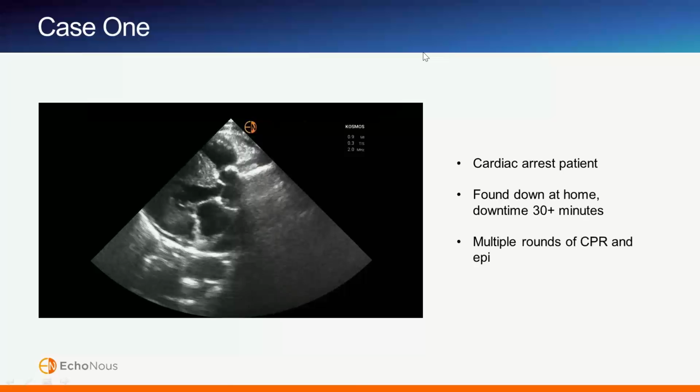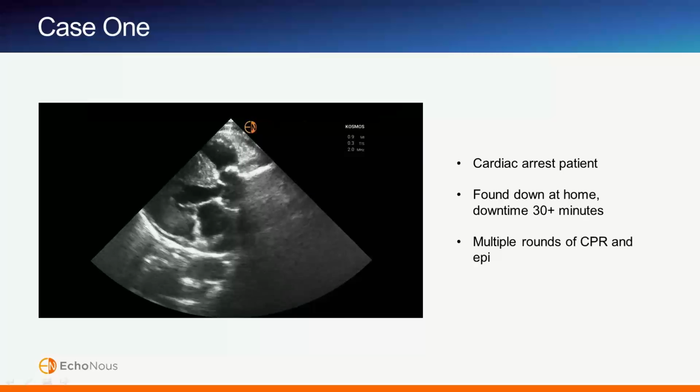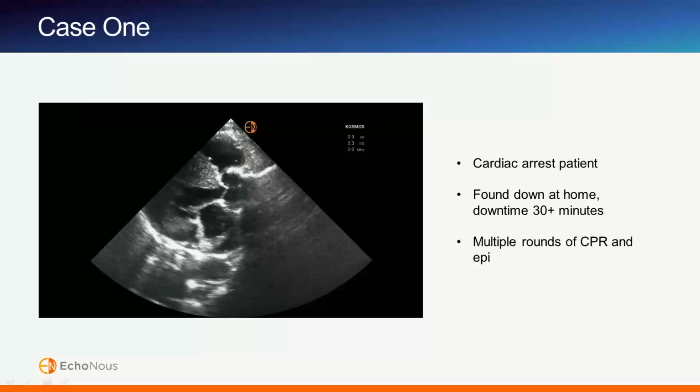Yeah, it's so tricky. There have been some studies that show that if you do still have the presence of cardiac activity, then that's obviously a better predictor for survival, and there are various studies looking at survival to 24 hours, survival to discharge, survival with good neurologic outcome. I think probably the more reassuring thing that we're looking for in these cases is cardiac standstill, because I think that is easier for us to stop, like the absence of any movement.